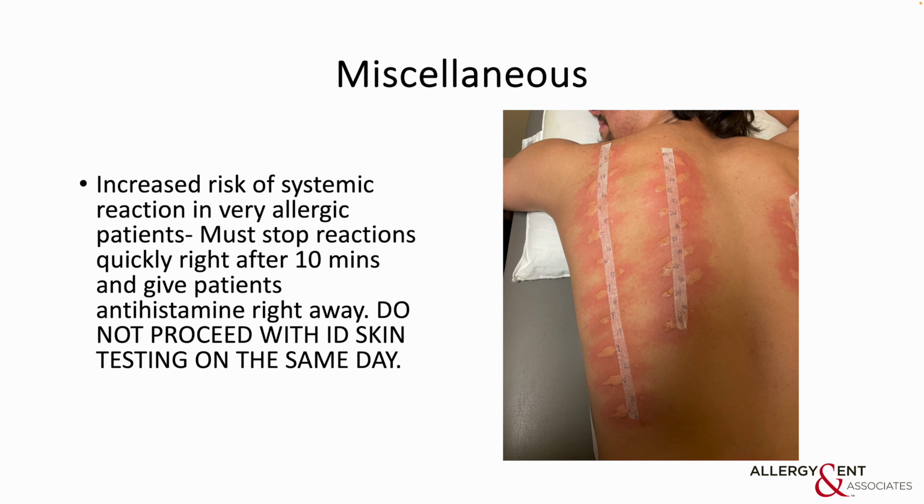For patients who are very allergic, you increase the risk of systemic reaction. So you must stop the reaction quickly right after 10 minutes and give the patient antihistamine. Do not proceed with the ID skin test on the same day. Remember, we set the alarm to check on the patient 10 minutes after placing the test so that we can make sure everything is okay with the skin testing.